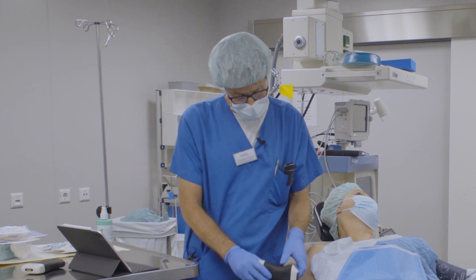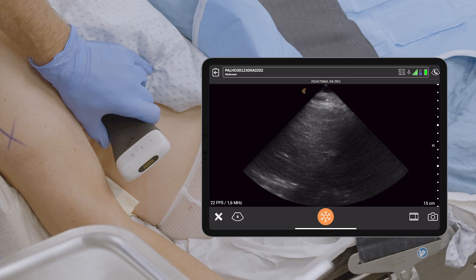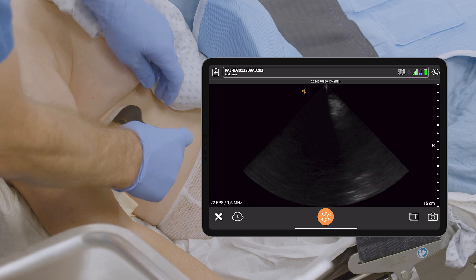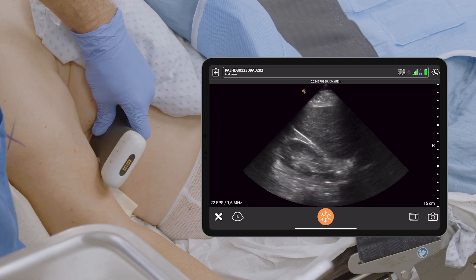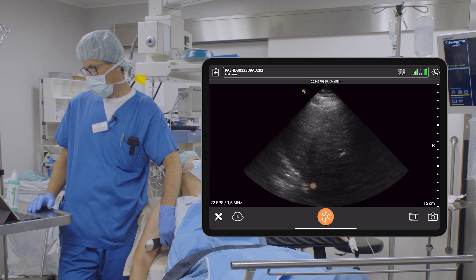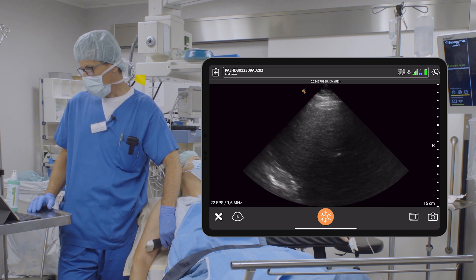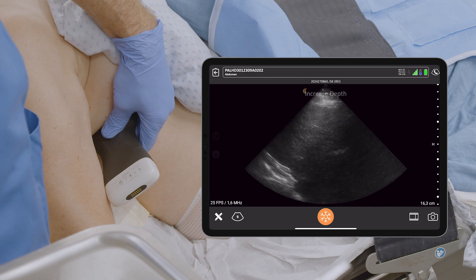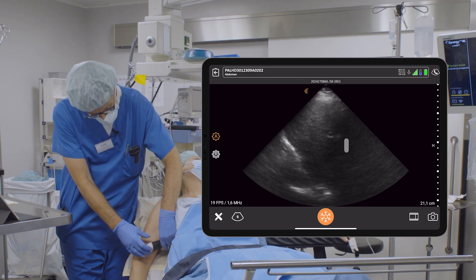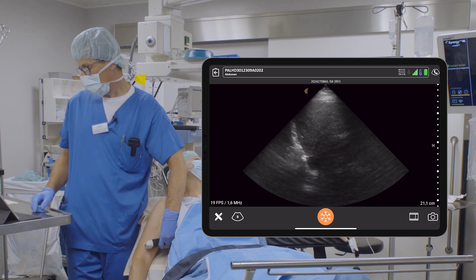I'll quickly demonstrate by placing the probe in an intercostal window to find a good window for diaphragmatic function. Here we have the diaphragmatic function. Now I can voice command: 'increase depth.' I can also use my fingers, and now I will have the diaphragmatic view on.